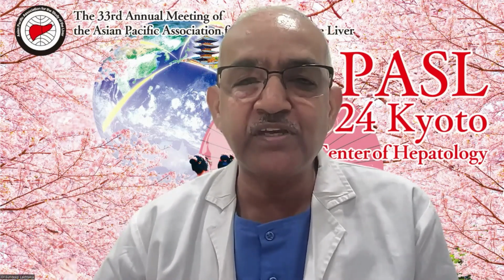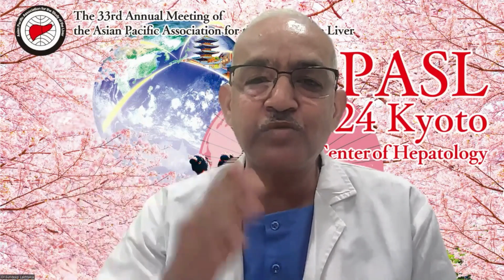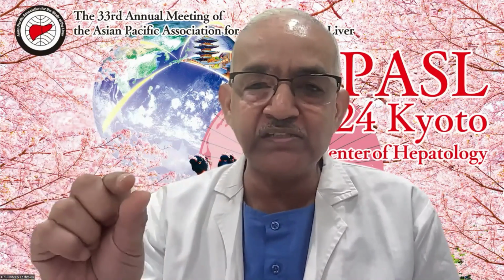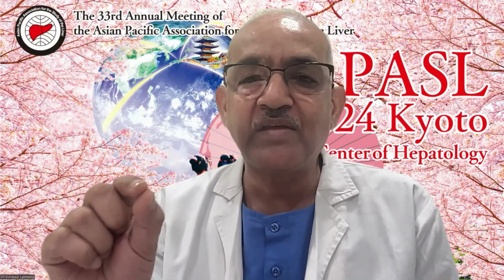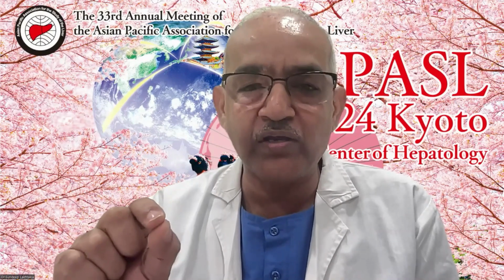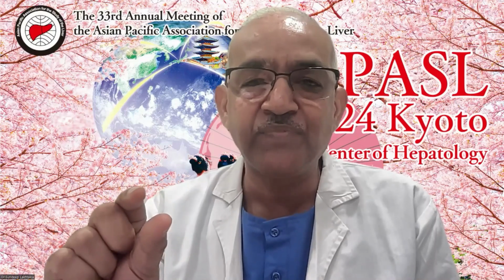These feeders are basically vascular channels which communicate between the intraluminal varices and the extraluminal varices. Those channels, which are smaller in caliber, can be attacked with glue or a coil, preferably a smaller size coil depending on the size of the channel.